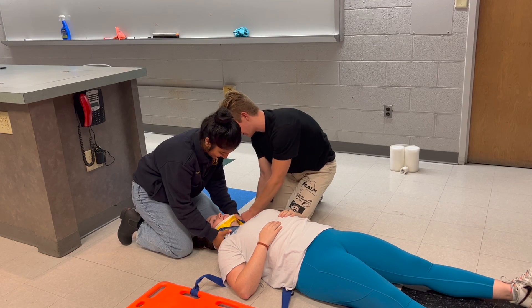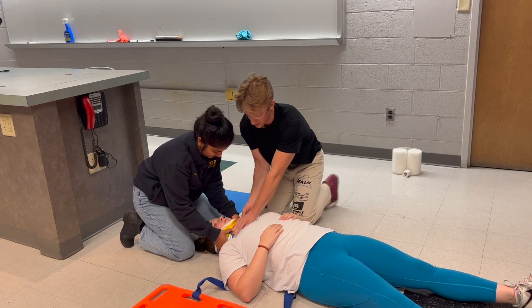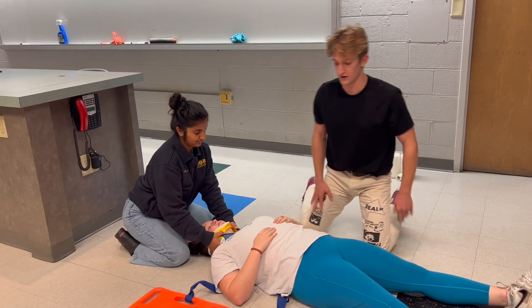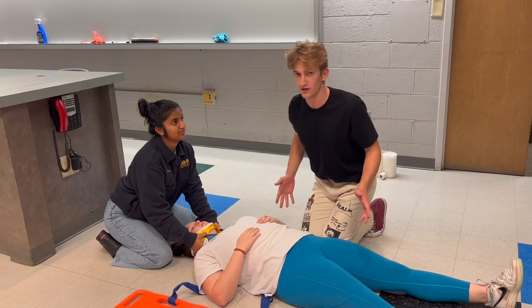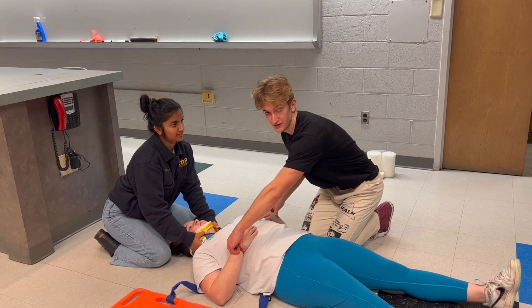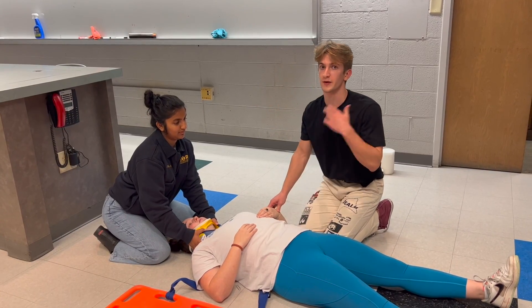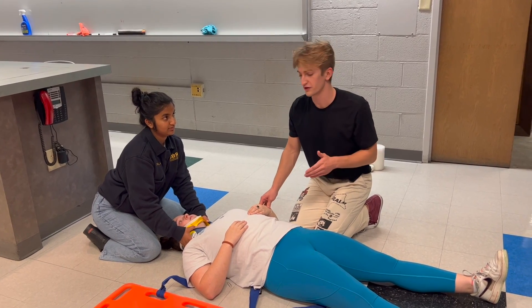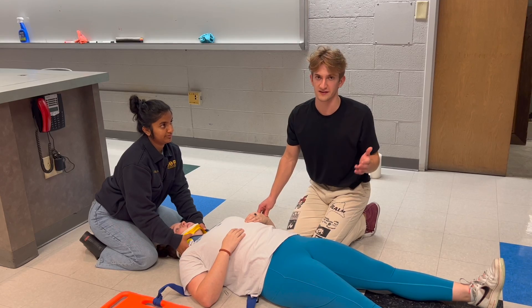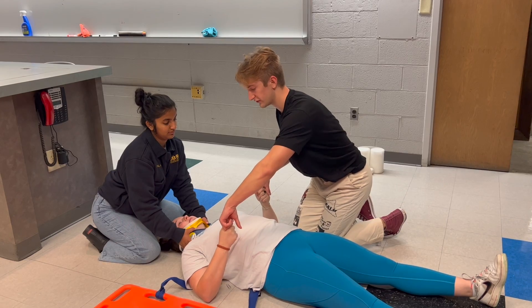Ashanti is going to move her C-spine immobilization onto the C-collar now, and at the end of our rapid trauma assessment we'll perform PMS. For a full spinal immobilization you will first assess pulses. If the patient is conscious or unconscious you will attempt to do the motor and sensory, and you can document if they're unconscious that you tried but could not assess motor and sensory.